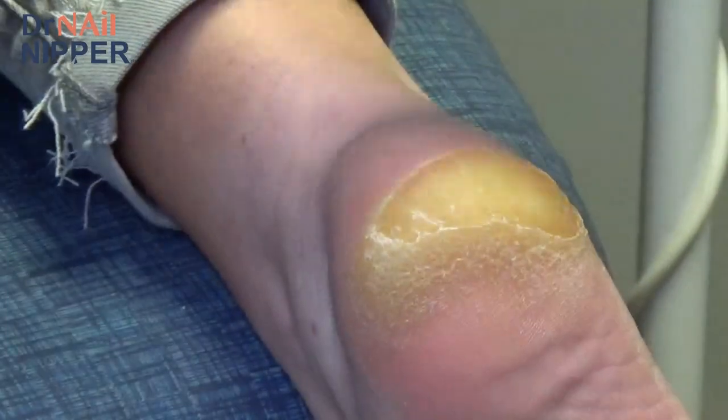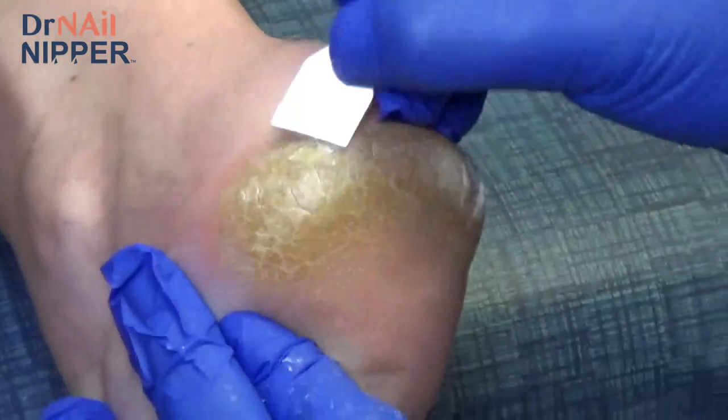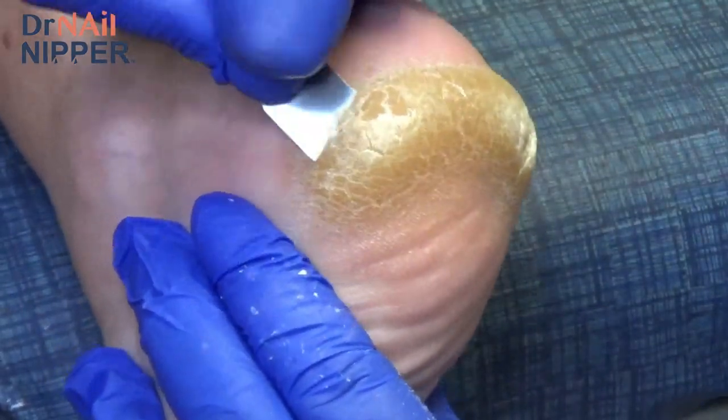Get those edges with the smaller scalpel. And then we'll smooth them all out using a sander. Mm-hmm. That's what he did, yeah. Okay, good.